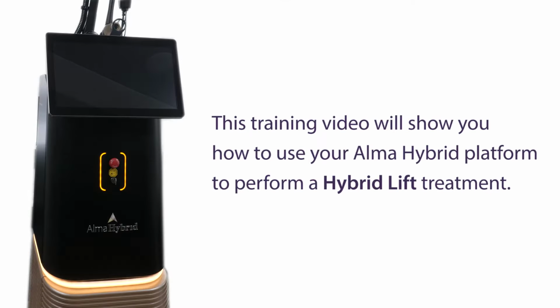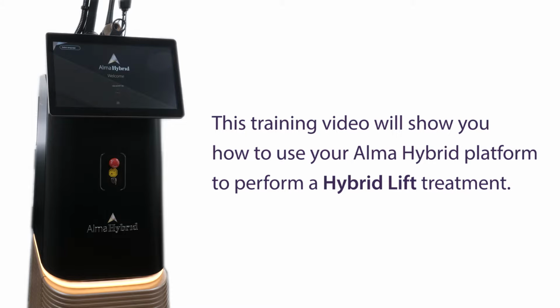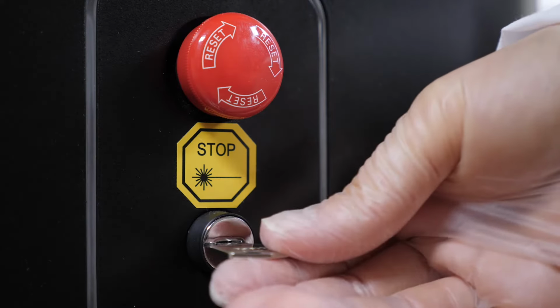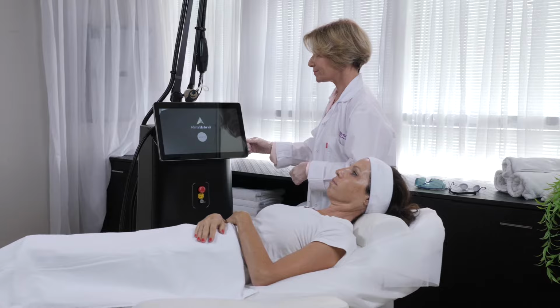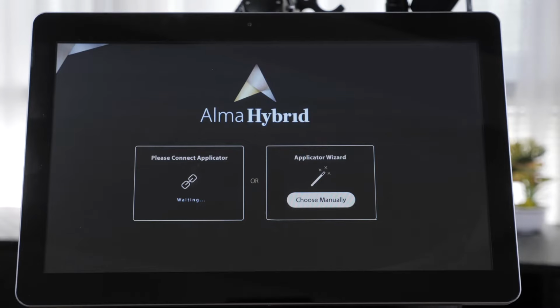This training video will show you how to use your Alma Hybrid platform to perform a hybrid lift treatment. Turn the key clockwise. Tap the Start button. Press Start Self-Test. The platform performs a quick self-test. Upon completion of the self-test, the main menu will appear. You can either choose to browse through the wizard or connect an applicator.